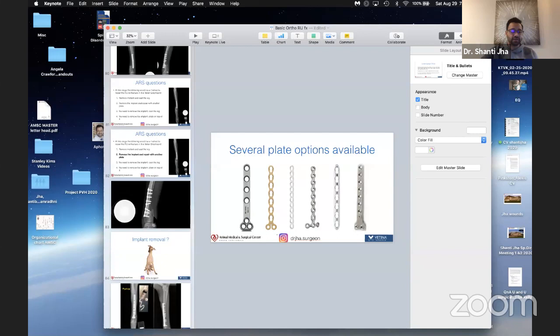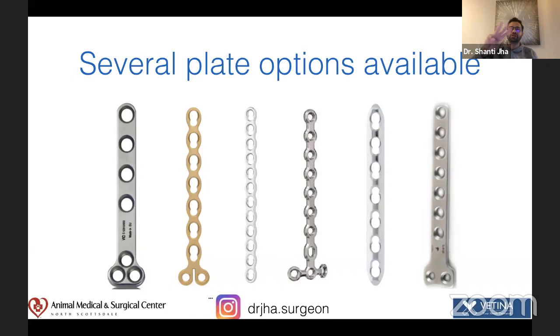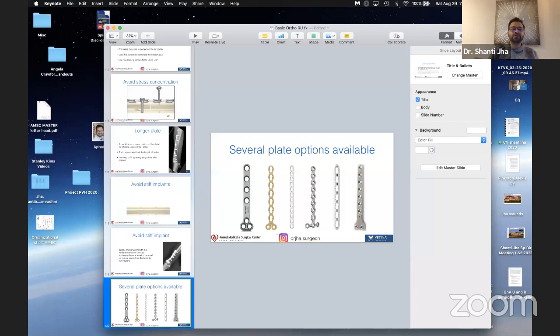So if you look at these plate systems, again, let me blow this up right here. Looking at these plate systems, you can see how the T plates are made. There are three screws down below so that you can use three. Now, with science and technology, with some advancement, only two is required if you're using locking screw. Let me repeat this. If you're using locking screws.